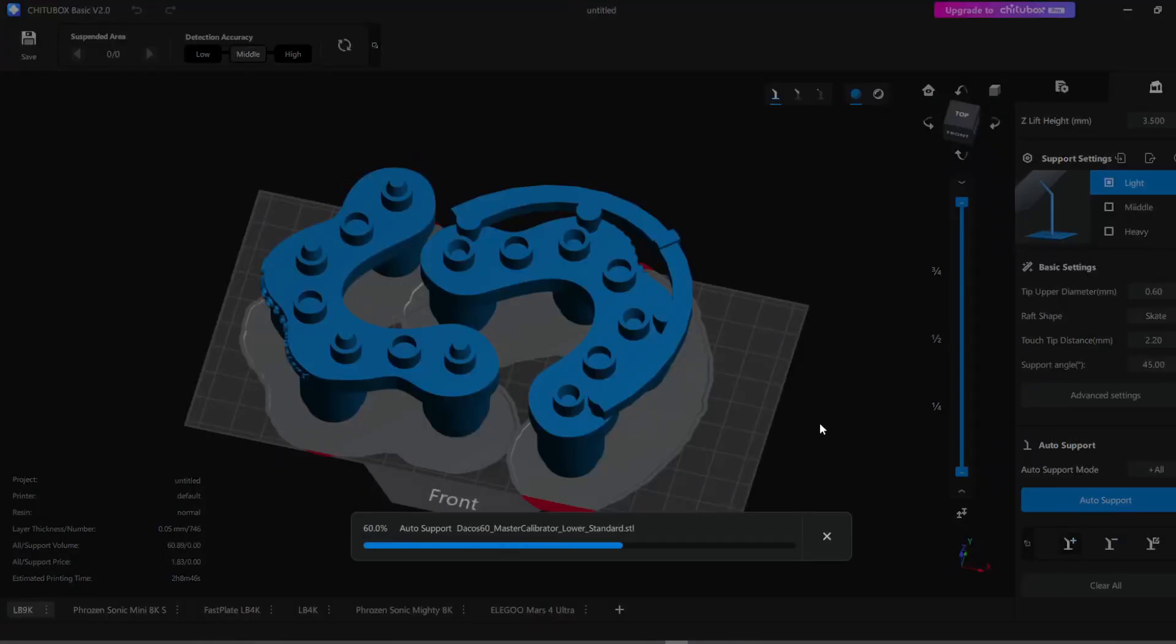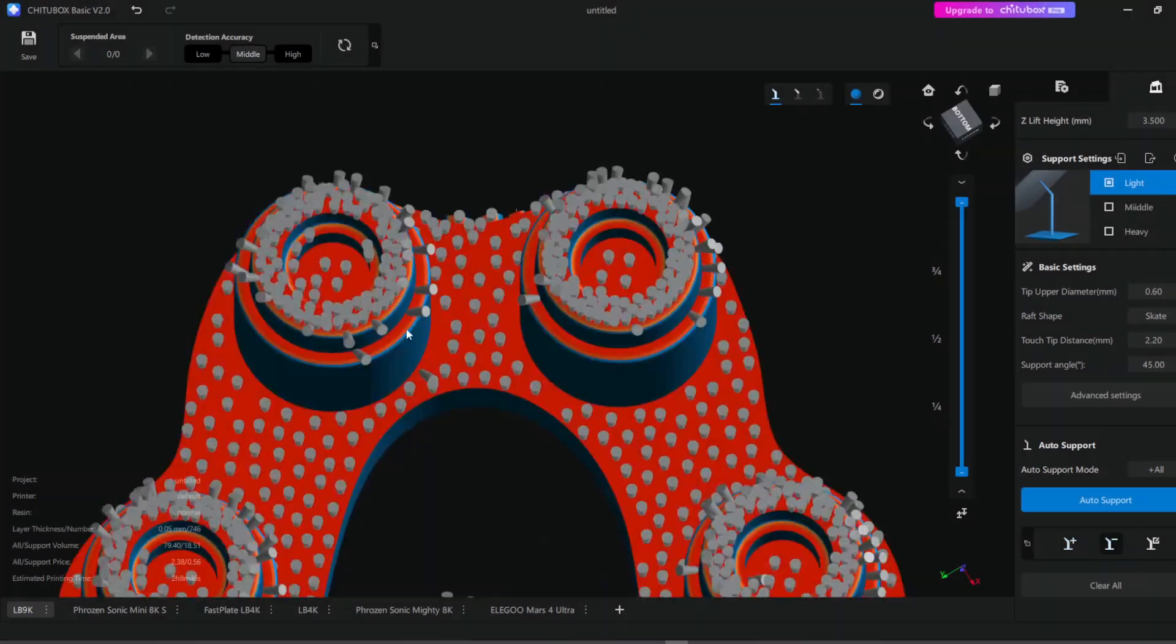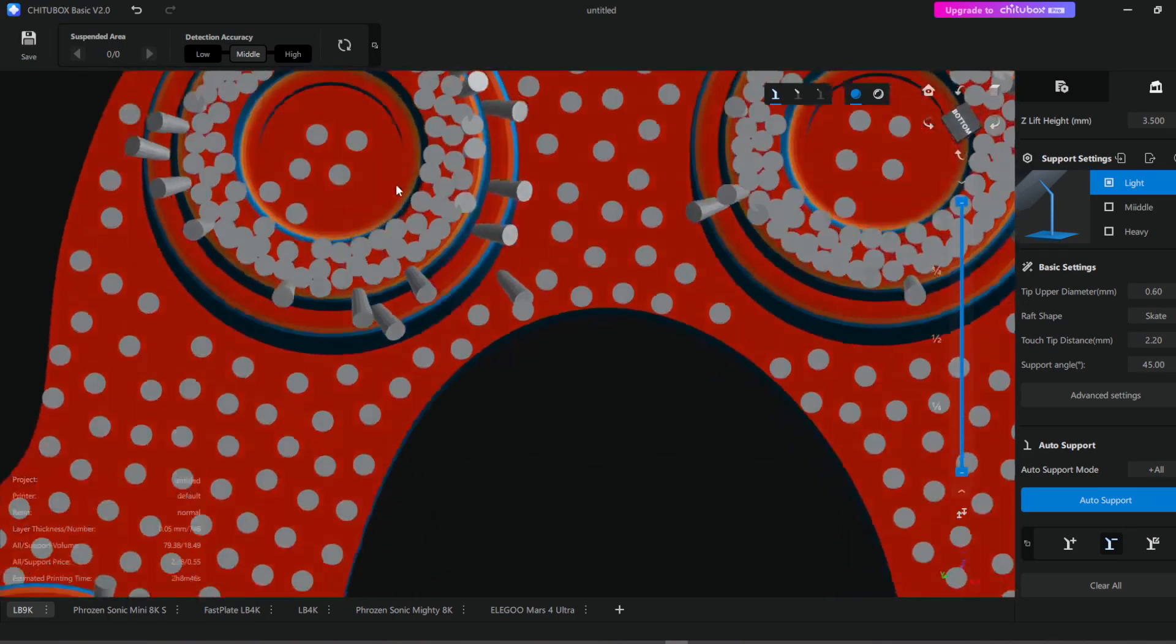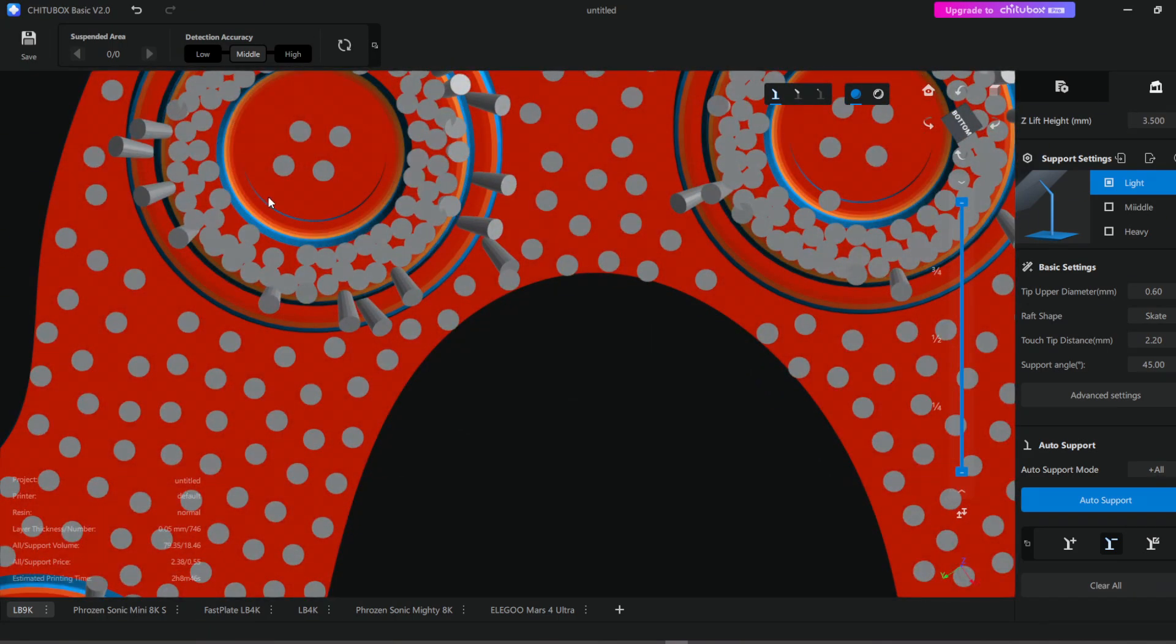Once both the upper and lower calibrators are positioned correctly, proceed with automatic support generation. After generating the supports, carefully check that there are no supports on the edge areas.